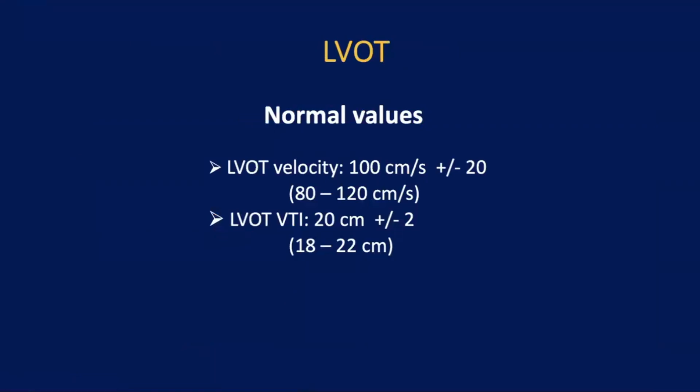So how to know sometimes, is it good or not? Is it acceptable or not? We should know the normal. Without knowing the normal, you cannot get what is abnormal. So what's the normal velocity for the LVOT? It's easiest to say 100 plus minus 20. There are multiple numbers proposed. Maximum I have seen is 130. Beyond 130, they say it is elevated.